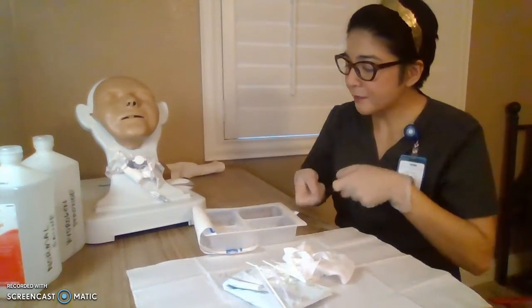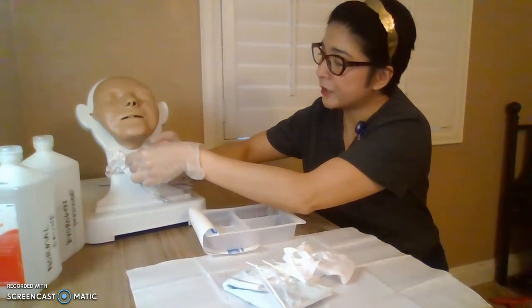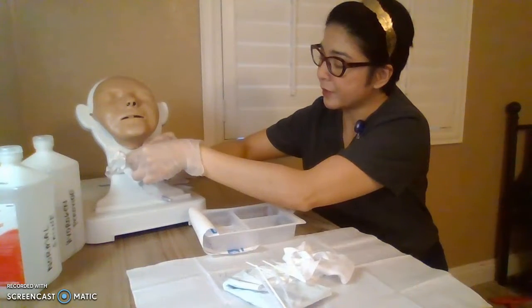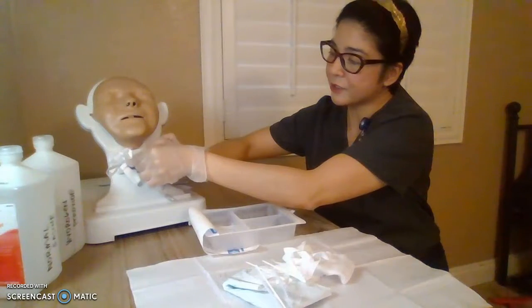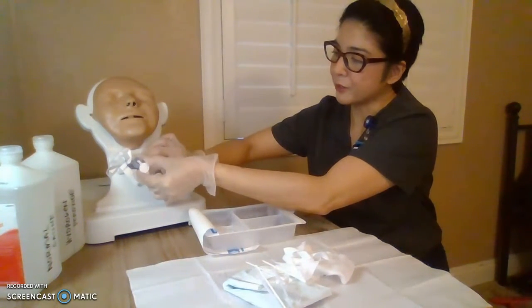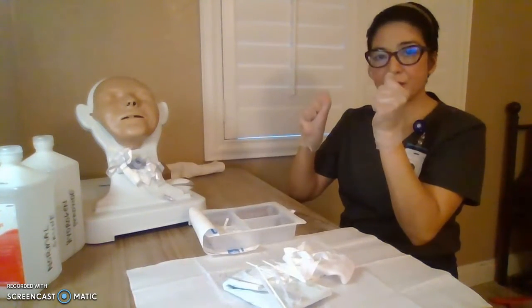Okay, Mr. Smith, I'm now going to start. Let me know if there's any pain or anything. You might feel a little bit of pressure, okay? So support your trach. Remove it, pull it out. Turn it if there's a lock, turn and pull out towards the curvature, within the curvature of the inner cannula. So there you go. And then you drop it in your 50-50 solution.